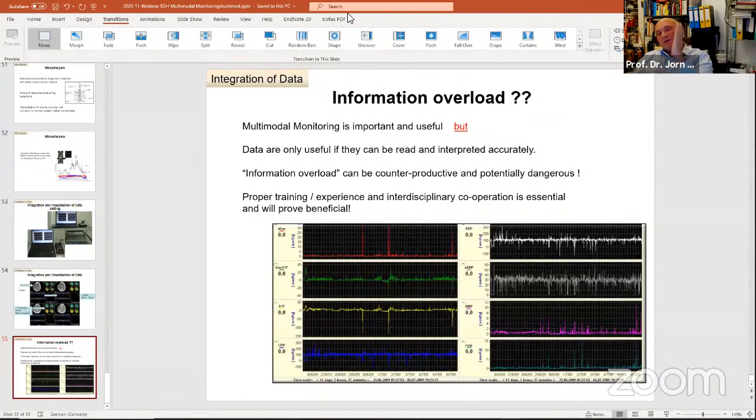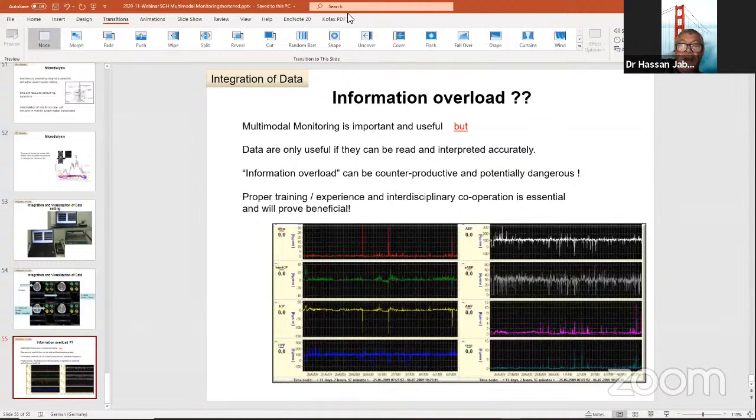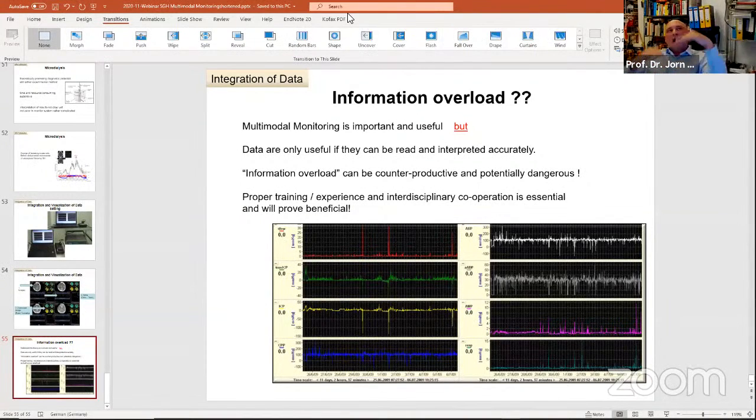If you know a patient is at risk and you are on the edge of whether to do a craniectomy or not, and I see the PO2 going down, I take that patient to the operating room. Okay, did you have cases of low PO2 and normal ICP? Well, the ICP is usually high normal, but if you put both probes in, as I said, we had those patients, and if you look backwards, the PO2 goes down first. So we switched our treatment scheme: in traumatic brain injury patients, we put in ICP and PO2, and when the PO2 goes down, we take the patient early to the operating room and do a big decompression.